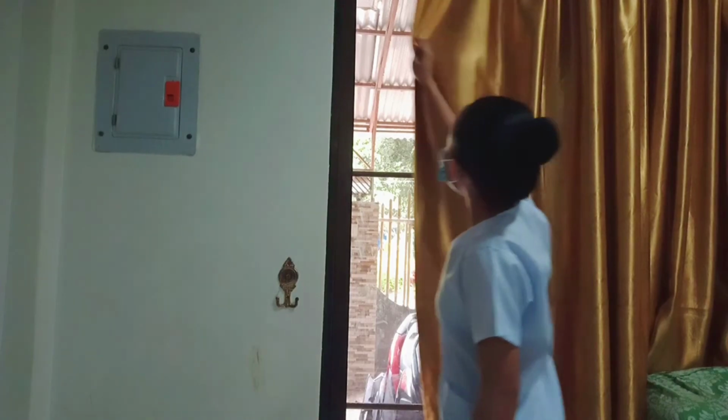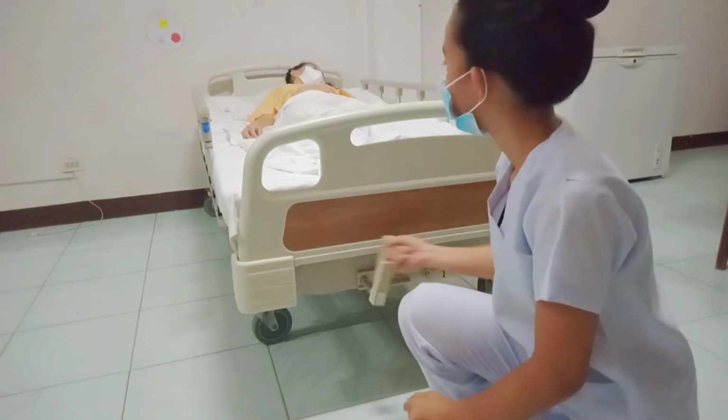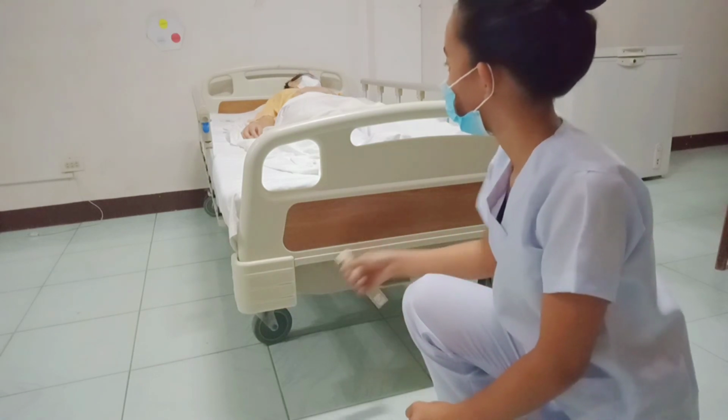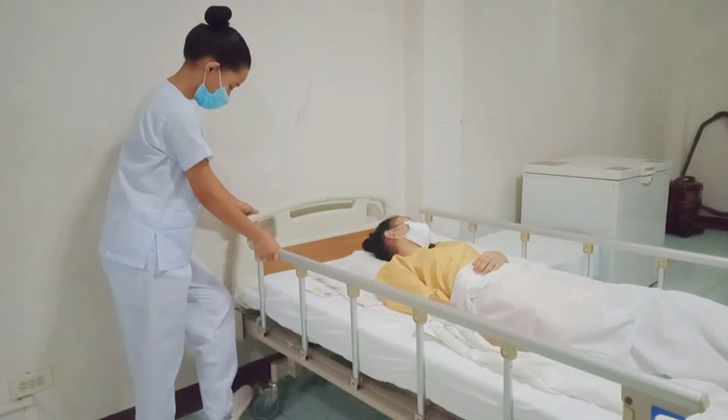And then, provide for client privacy. Adjust the head of the bed to a flat position or as low as the client can tolerate. And then, raise the bed to the height of your center of gravity. And then, lock the wheels and raise the rail on the side of the bed opposite you.